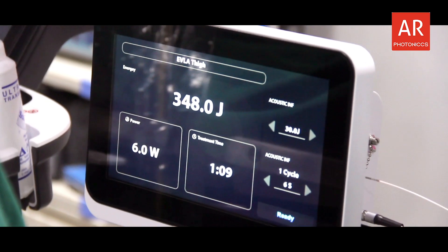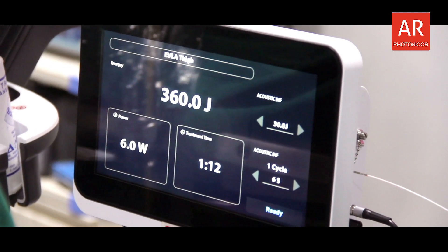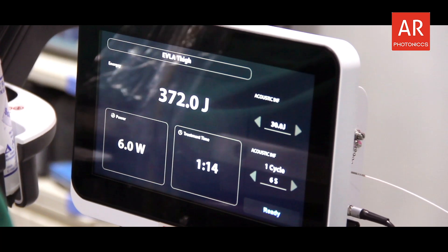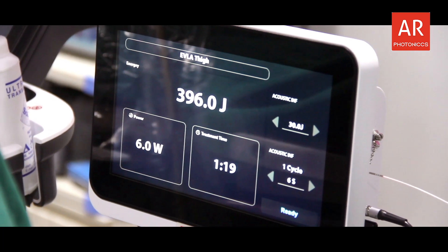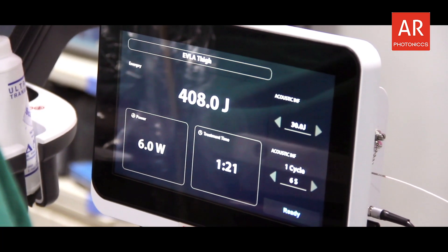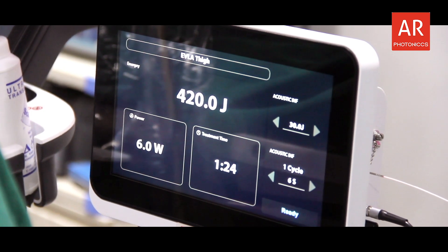The next marker is the skin marker — that is your endpoint. The skin marker has to come up to the top. With respect to time, if we are consuming more time for this procedure and the spinal anesthesia effect is wearing off — that's okay, we will use local anesthesia.